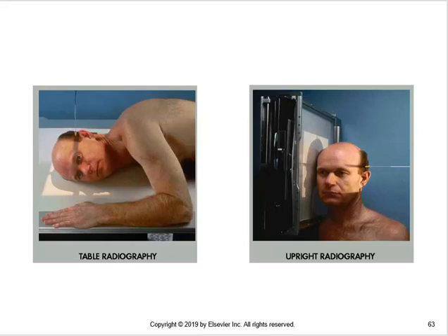But that loss of sharpness or recorded detail is probably better. That increase in OID is probably better than the mispositioning of having the patient at an angle, and therefore any possible pathology may be projected into the wrong place.